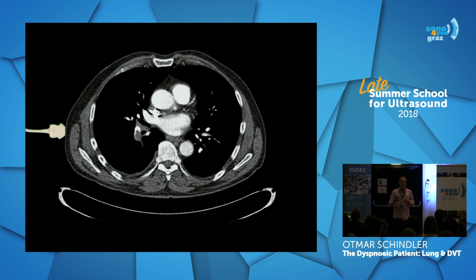Lots of thoracic wall and not much more. Yeah? If you put it here, you will see the shadow behind the rib and nothing more. If you put it here, you will see the chest wall and then perhaps some motion, but you don't see the lung. You never see the lung.